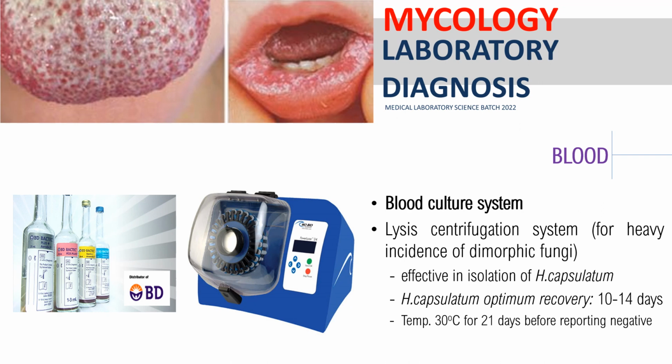Pero class, according to Mahon, okay, and also supported by Bailey and Scott, the reporting should be done after 21 days. Okay, although 14 days yung optimum recovery ng H. capsulatum, pero yung reporting should be 21 days para sure talaga. Then the temperature should be 30 degrees Celsius, class. Why? Because H. capsulatum is a dimorphic fungi. It means, class, that they can transform to yeast form at 30 to 37 degrees Celsius.